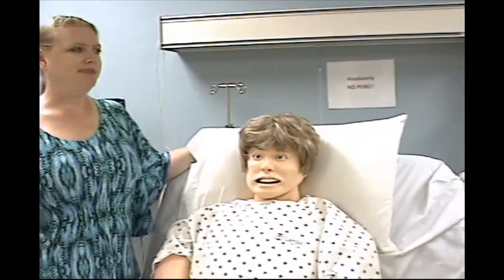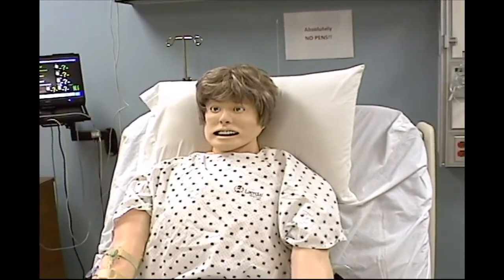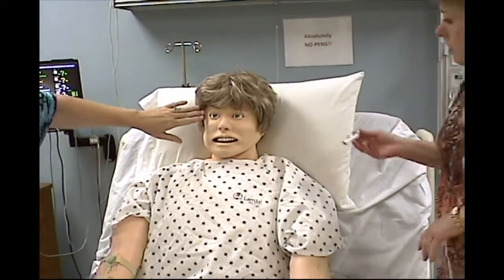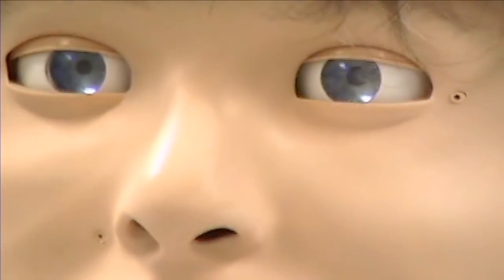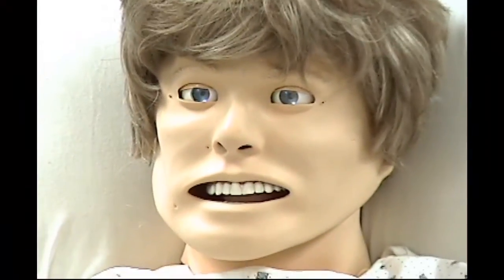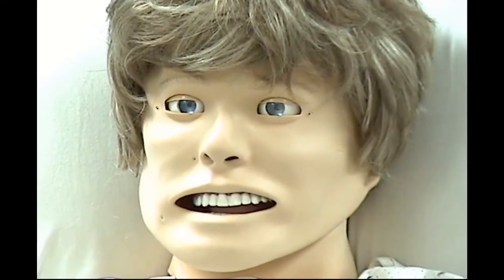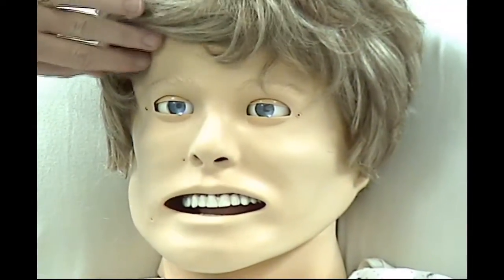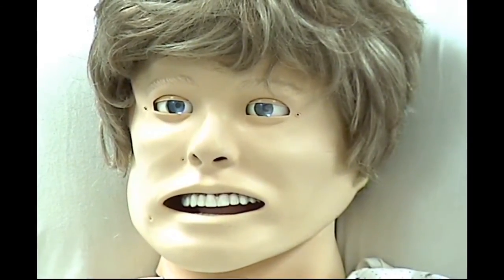Welcome. Now, you might have noticed that the simulator's eyes actually blink. The pupils will also react when a light source is shined into the pupil. The nasal and oral airway are functional and will admit a nasal or oral airway device. The pinholes across the forehead, the eyes, ears, nose, and mouth allow for secretions if called for in your simulation.